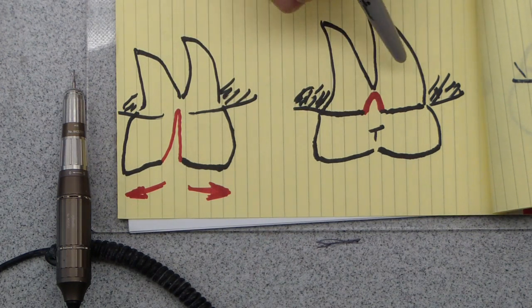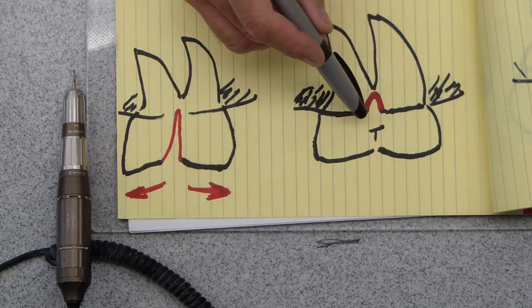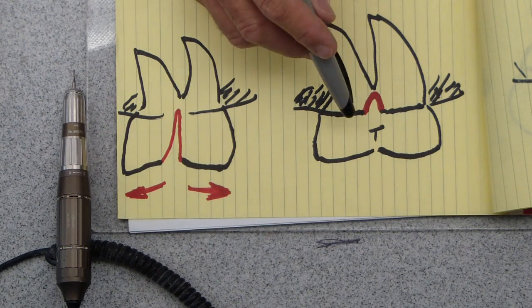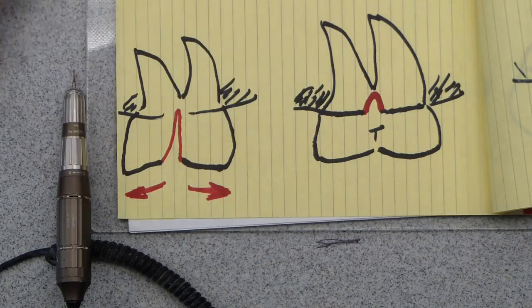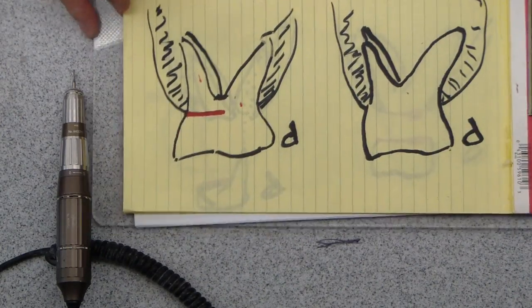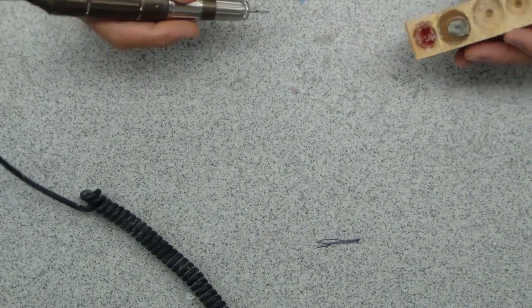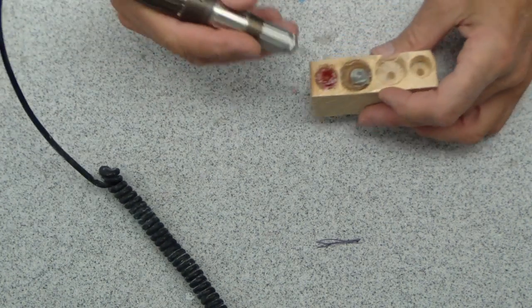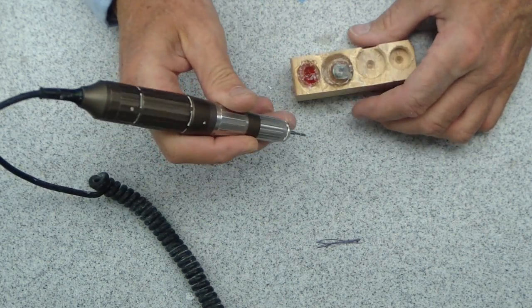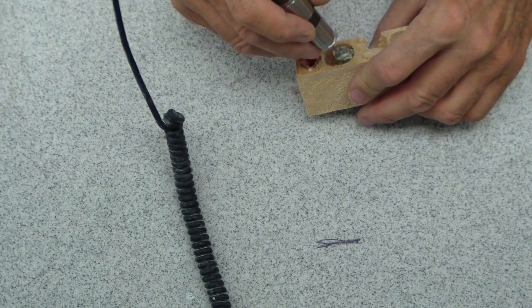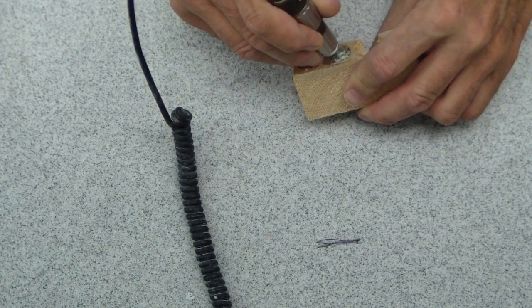On the elevators I like to get down as far as I can on the mesial-distal. So what I'm going to do is instead of using the forceps or the elevator right off the bat, I'll make a little access in here, get a little better grip on that and get a little better torque on that. Now you really don't even have to lay a flap. Do you lay a flap when you do a crown prep? Normally you don't, so as long as you're not going 10mm down there, you're just going a couple extra millimeters on both sides to get a good grip on it.